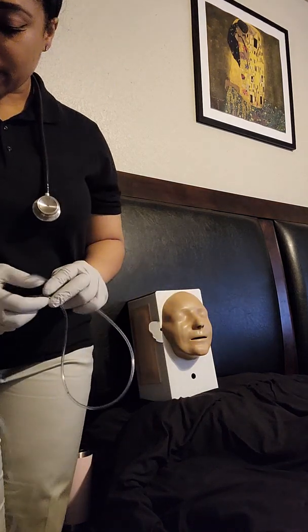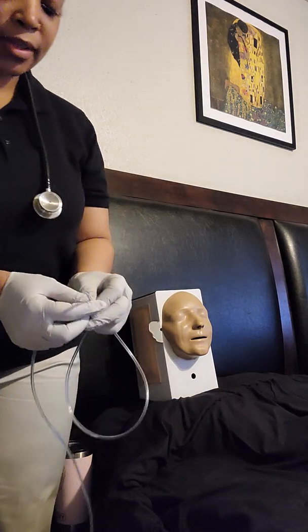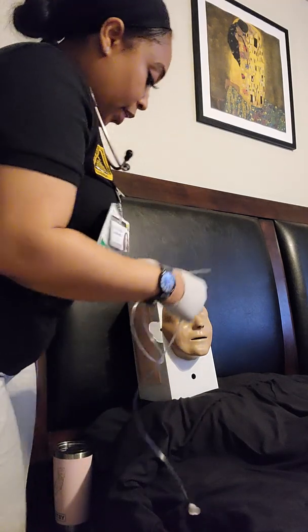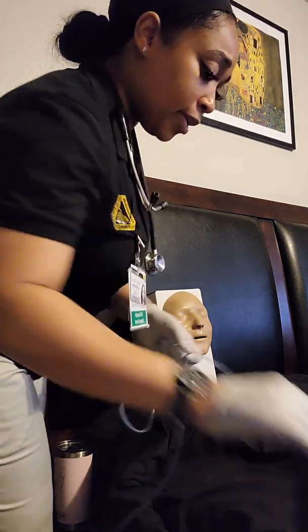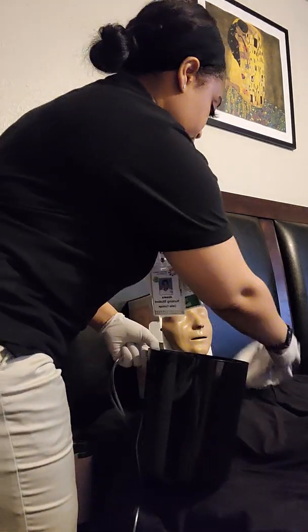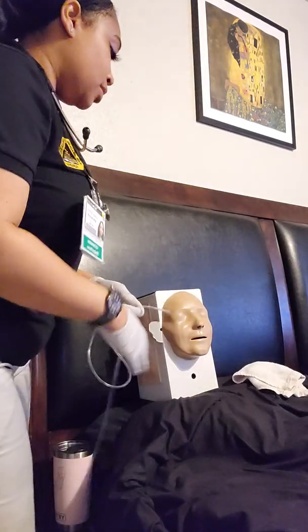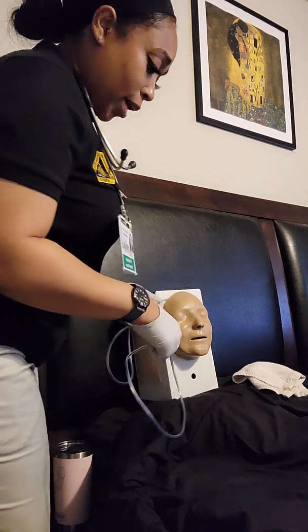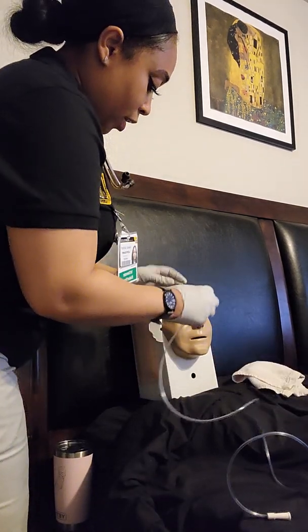Okay? All right, perfect. So now I will go ahead and apply some lubrication from the tip to about 2 inches up. All right, so please remain calm. Try not to grab the tube. I do have a tissue here just in case you do have some tears. And I have an emesis basin just in case you feel like you need to vomit. But please do not grab the tube, okay? Please do not move your head. I do not want you to get injured at all, okay? So I'm going to go ahead and start.